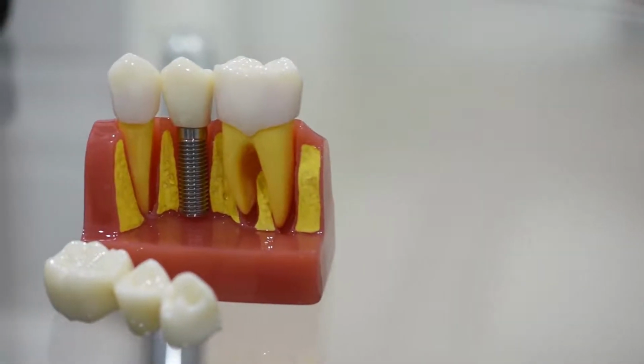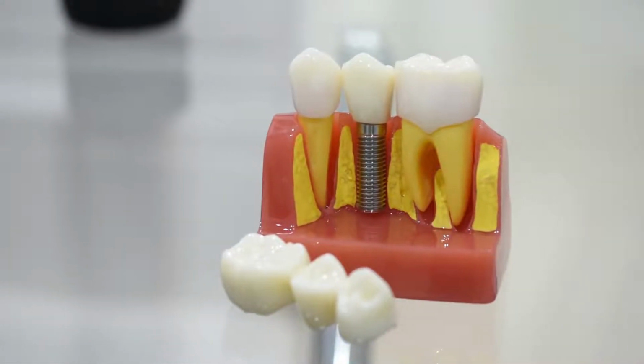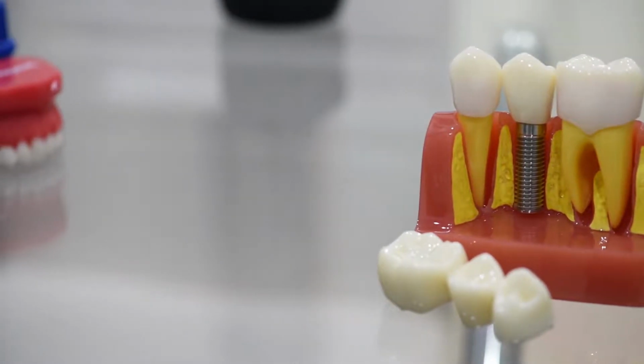There are usually about 3 options when deciding to replace a missing tooth. You've got the implant, the denture, or the bridge. So why would you want to use either of these options? A denture is a removable option. If you compare it with an implant, an implant is fixed. That means it is actually screwed into your bone.